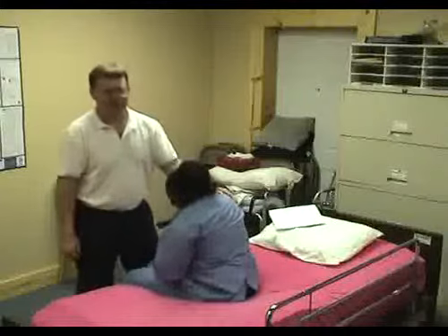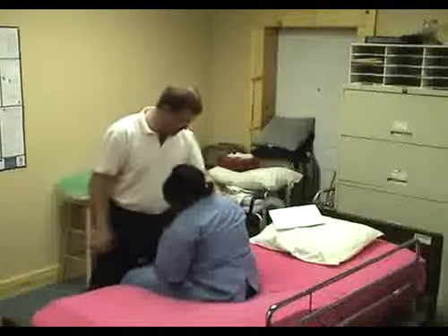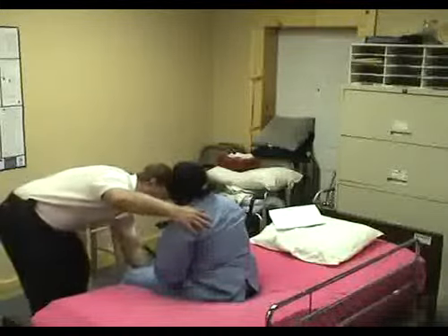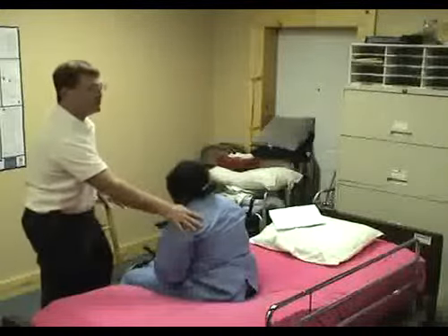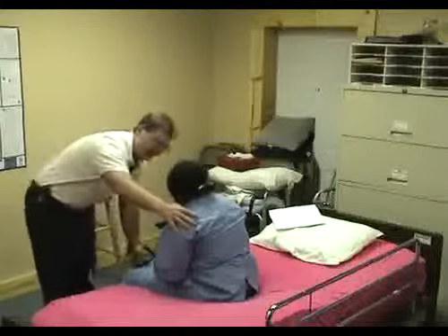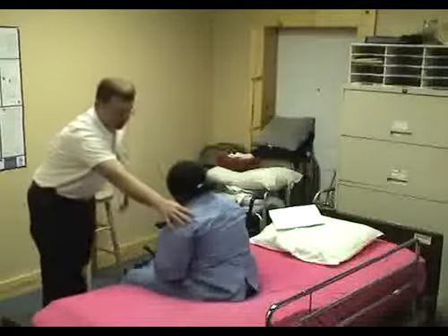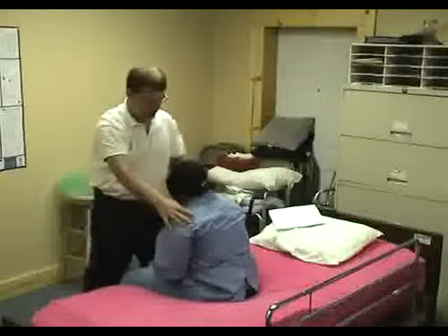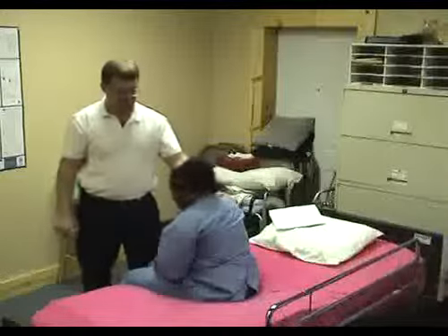She's just playing. Don't you want to move the legs of the chair back? Actually, don't hit into those. I flipped them up. You could move it back, but I flipped the foot pads up so that when she comes down, they shouldn't be in the way. You can set them up and stuff. There's lots of different kinds of leg rests on wheelchairs. Most of them have a button on the side. You just push, and it'll open. It'll swing it right out away from you. I had it like that until we moved the wheelchair. I'm closing it. I'm just going to help you. Give y'all a good example.